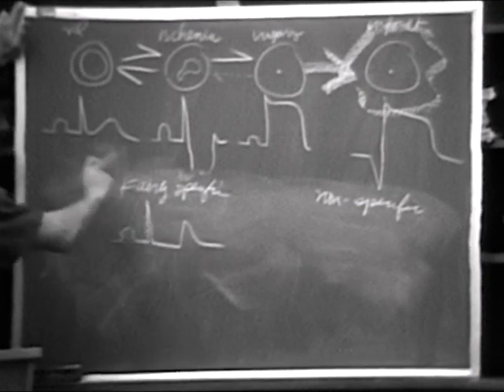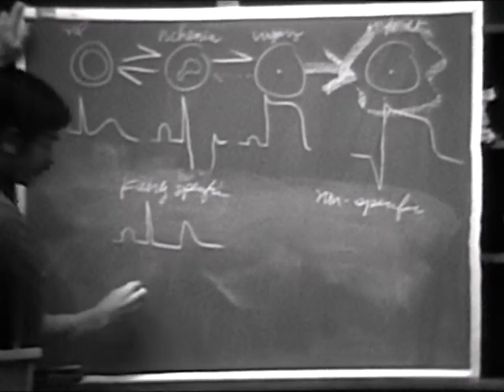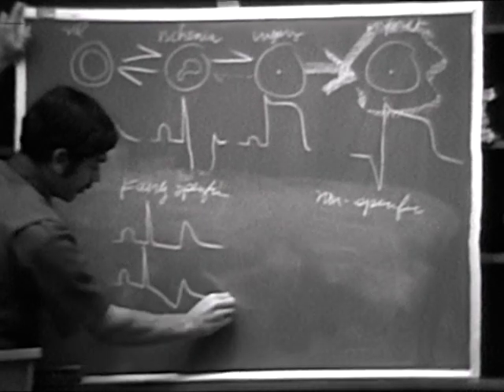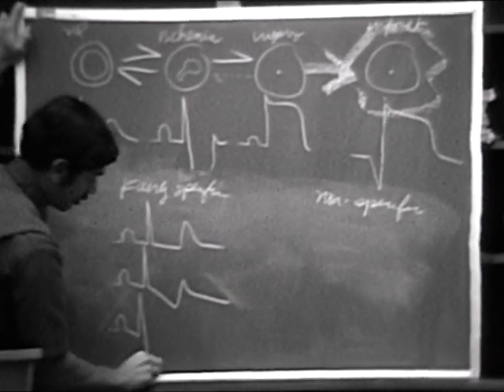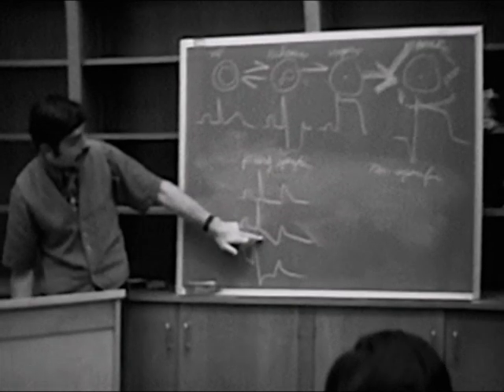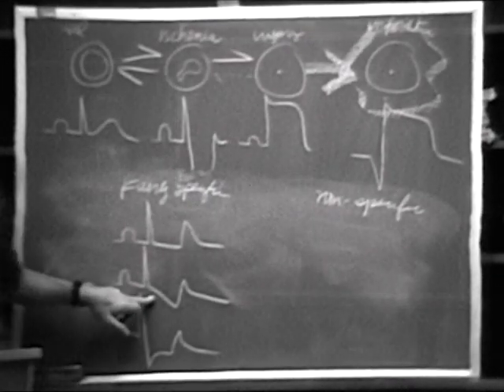Can you see a change there from this pattern? There's a change. Okay, now let me just go on to the next. You can see what we're really getting at here. This is a little bit more severe. And then finally, frank depression. Okay, so you can see, if you look at this, how these are all just different degrees of the same sort of thing, right?